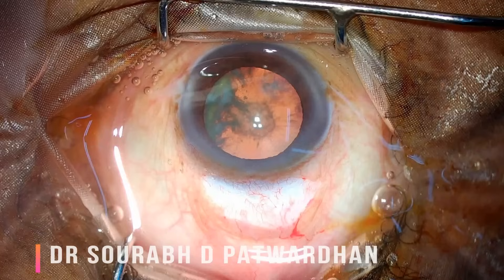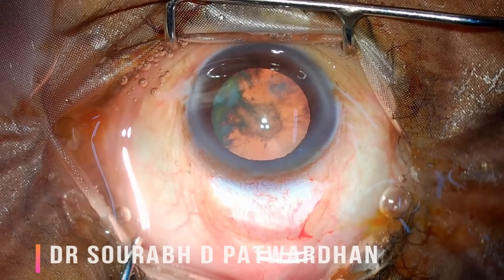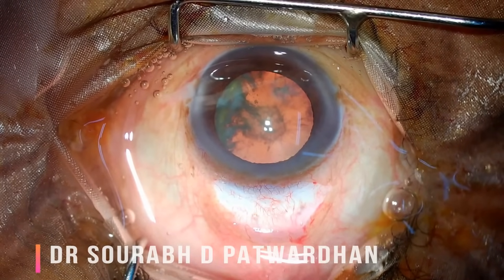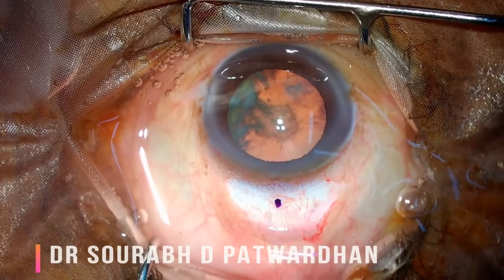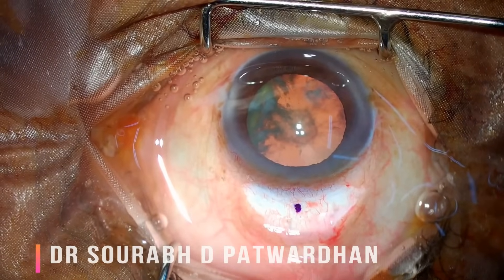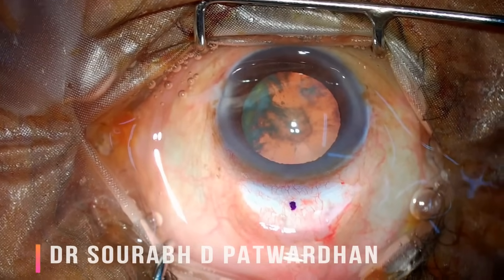Always measure where you want to start the scleral tunnel. For beginners, I recommend making the scleral tunnel at 1.5 millimeters from the limbus. Mark that point where the scleral tunnel will be closest to the limbus, then you can either take a straight incision or a frown incision, and that incision should be 6 millimeters.